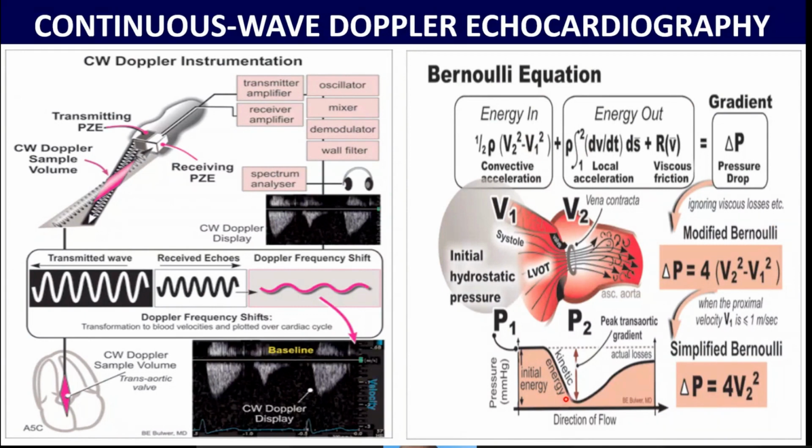Here it's also necessary for us to know, especially when we talk about the aortic valve, that as the blood passes through this narrowed orifice, there will be negative pressure generated here, and the pressure becomes recovered somewhere across the aorta. That is called the pressure recovery phenomenon.